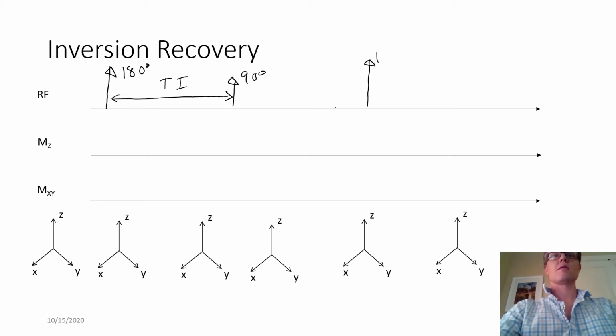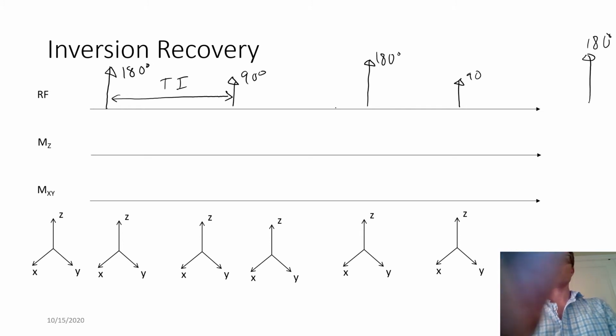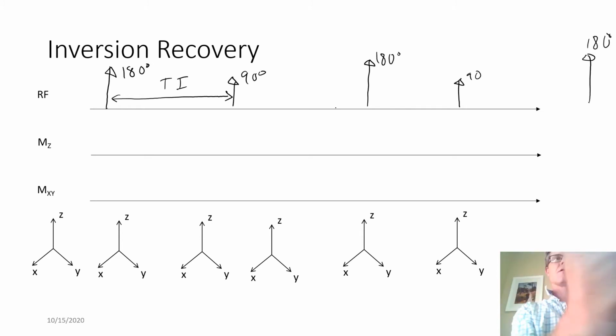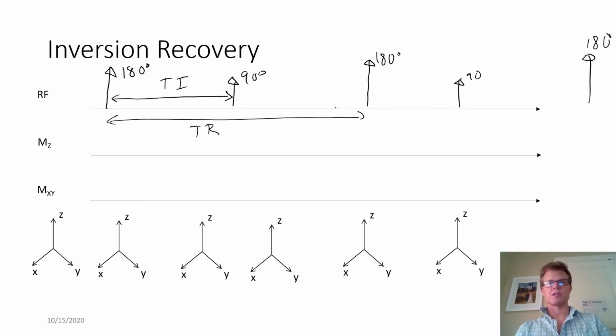And then, as with the saturation recovery and partial saturation recovery, this same pattern is going to be repeated. And the interval at which it's repeated, here I can label it either case, it's going to be TR. So again, we're going to have a repetition time.